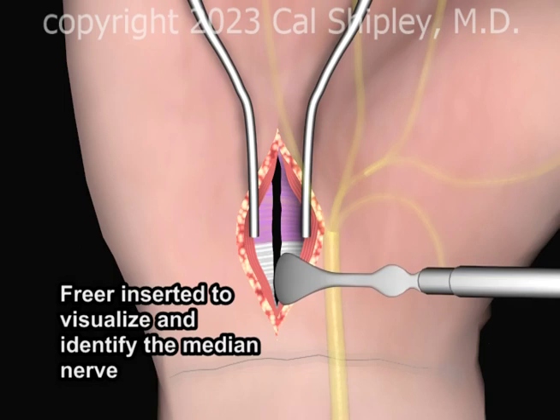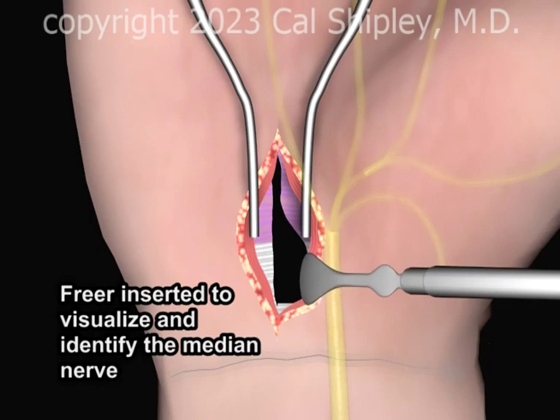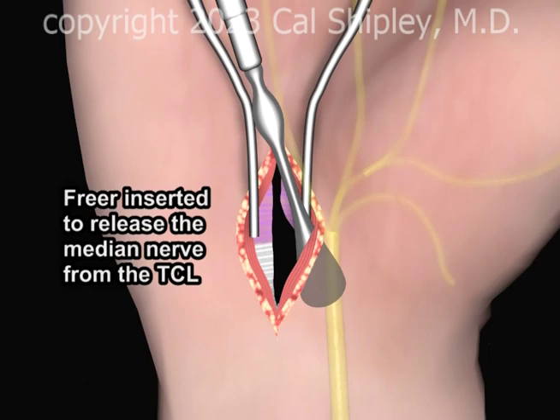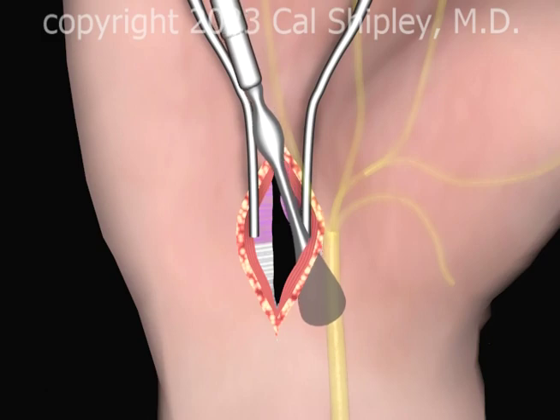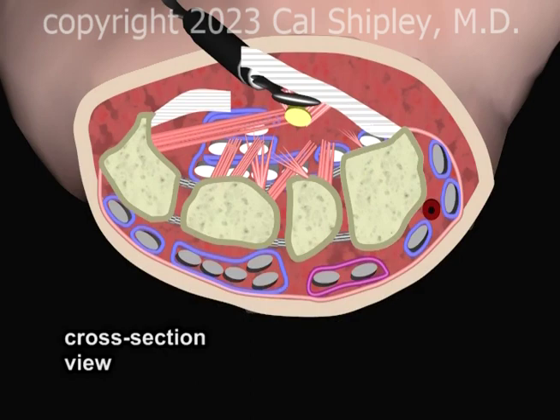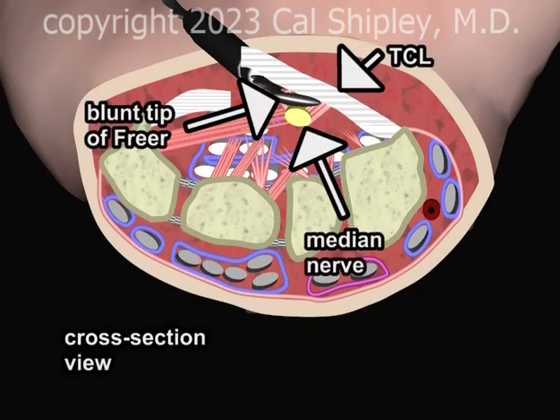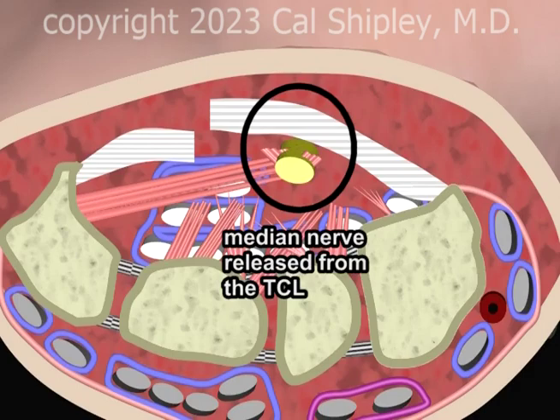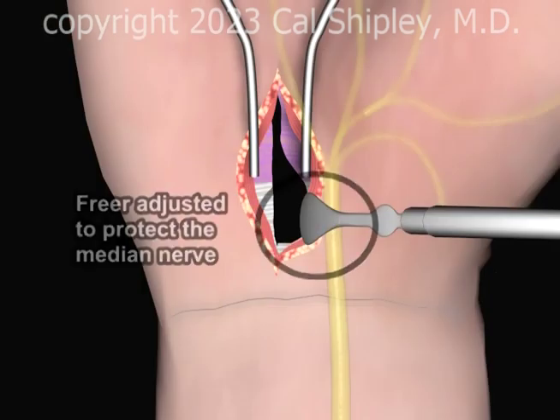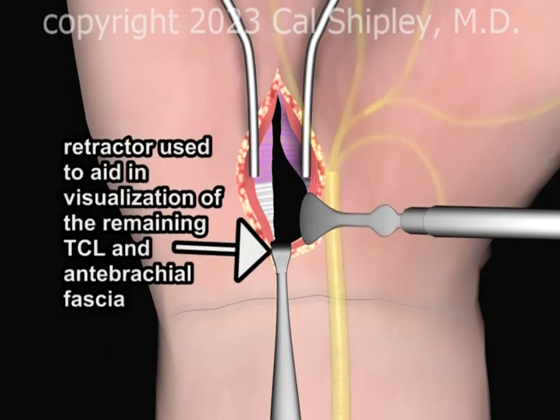A freer elevator is used to ascertain the precise location of the median nerve. The freer elevator is then reinserted to protect the median nerve so that the remaining portion of the transverse carpal ligament and a portion of the anti-brachial fascia can be opened.